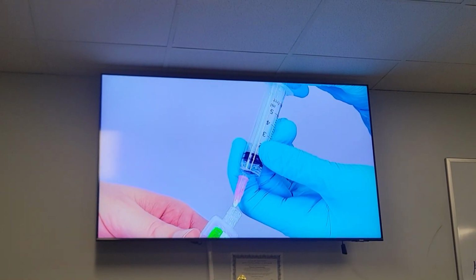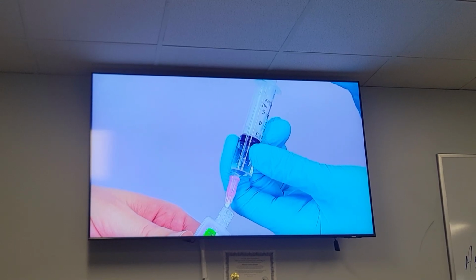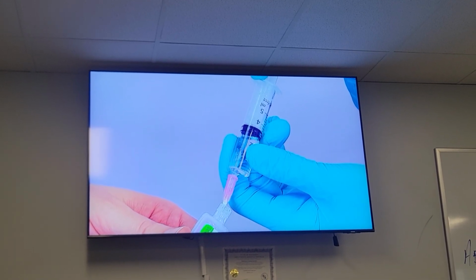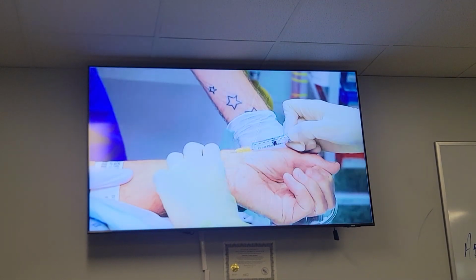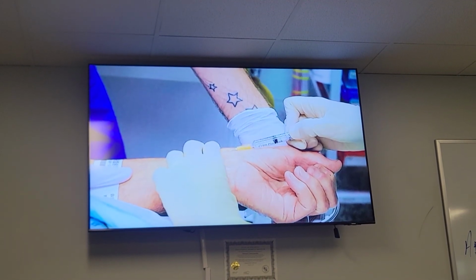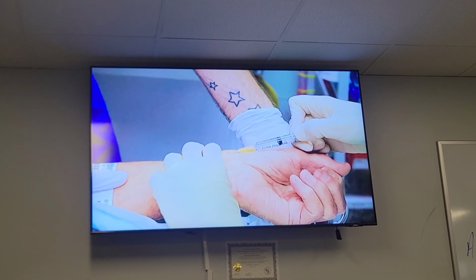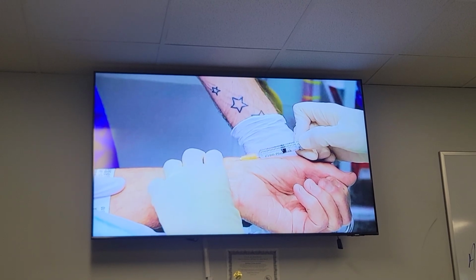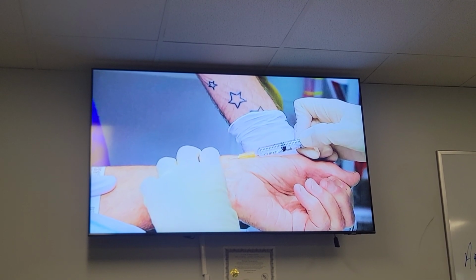Some individuals prefer to inject local anesthetic at the site where the ABG sample is going to be taken. However, if performed well, the procedure should be completed in a single puncture, so the additional puncturing of the skin and the discomfort from injecting the local anesthetic itself essentially nullifies any benefit from using local anesthetic in the first place. So in our case, we won't be using it.